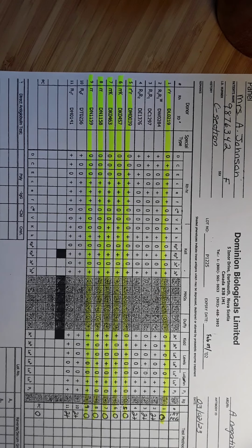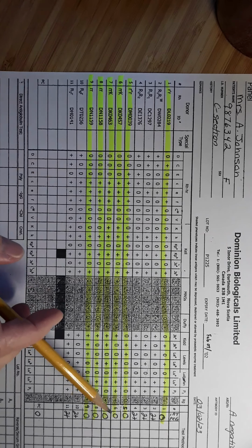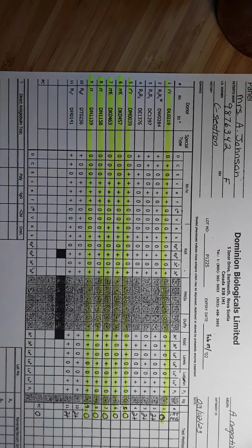Now the question is, why? Why am I highlighting the negative rows? Well, if you look back on page 3 of your module, you guys all took the time to read that. The second paragraph says, actually I'll read the bold part, the presence of an antibody is ruled out by demonstrating non-reactivity of the patient's sample with the panel cells that demonstrate the corresponding antigen.